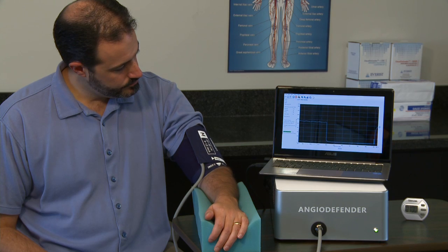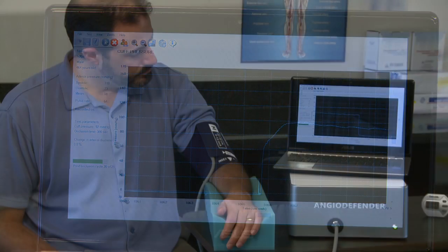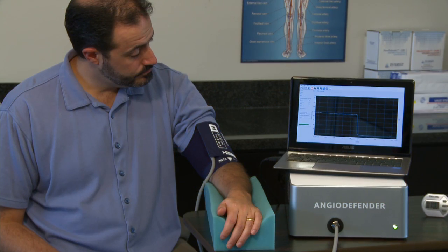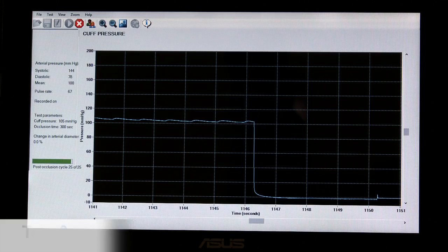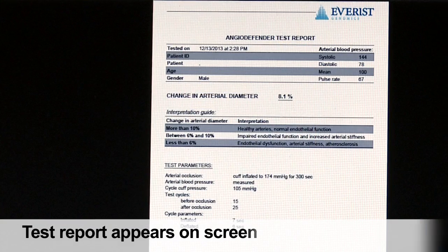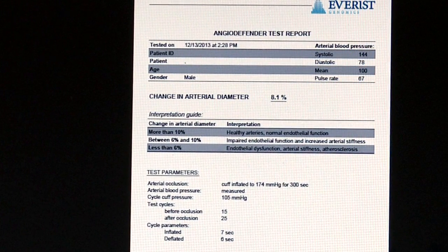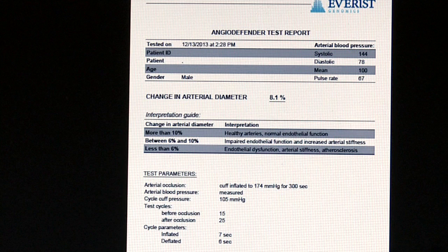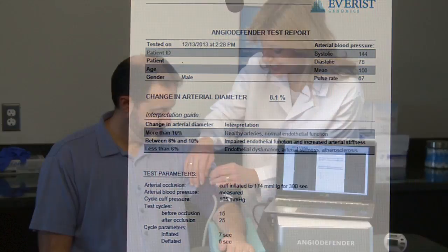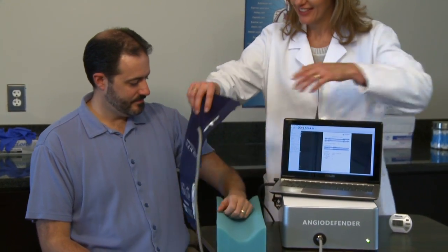After the completion of these 25 inflations, there is a delay of several seconds, followed by the appearance of the test report on the screen. The report displays the patient's percent of flow-mediated dilation as a percent change in arterial diameter. It also displays the patient's systolic, diastolic, and mean arterial pressures, pulse rate, and patient information entered prior to testing. The cuff is then removed from the patient's arm and the test is complete.